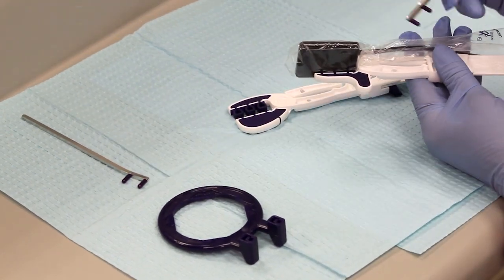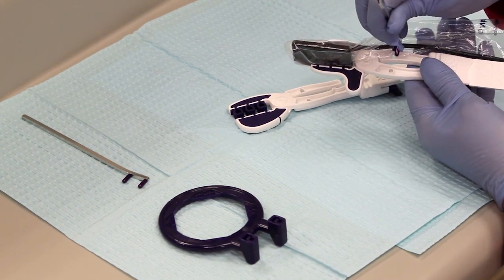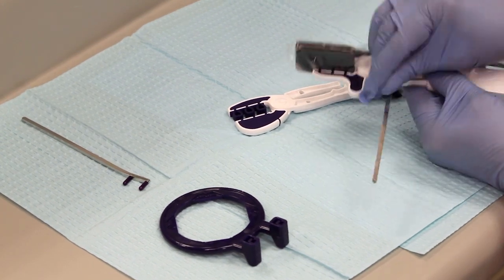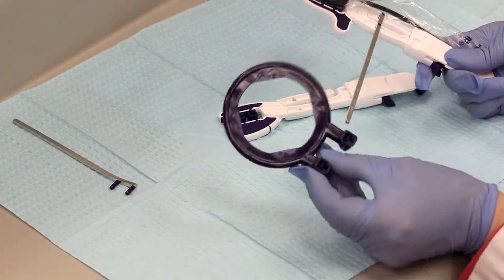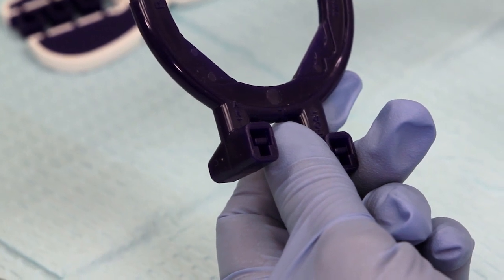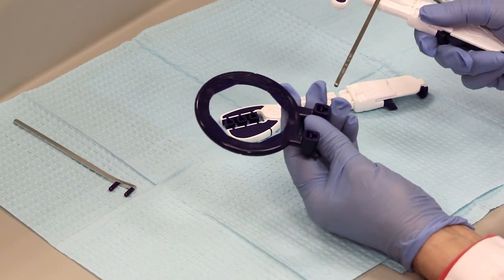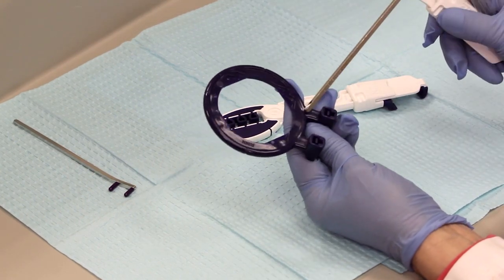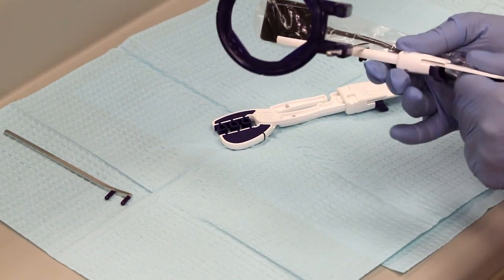Many assistants prefer to use the ring system with it, so you can actually use these two holes here, place the bar into the holes, and slide the ring on. On the ring itself, it says anterior and posterior, and you're going to slide it on the side for the tooth that you're doing. We're currently going to be doing a posterior tooth, so I'm going to use the posterior and slide this in — and now you're good to go.